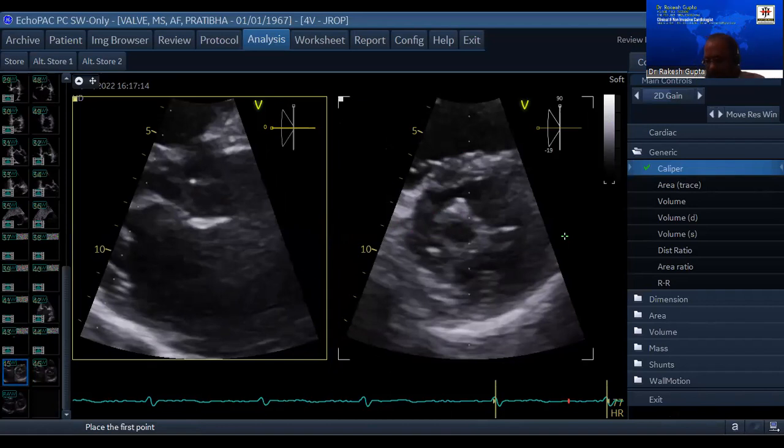Let me go to the fifth person now. Dr. Ghanshyam Motisaria. Yes, sir. Tell me the next feature of mitral stenosis. There will be thickening of the leaflet. We have already done thickening. Restriction of mitral cusp separation is done. Commissure thickening is done. Dilated LA is done. The motion of AML and PML is not reciprocal; they are in the same direction. Okay.